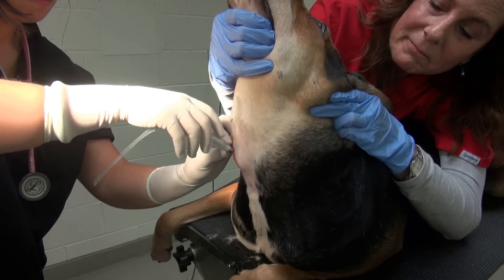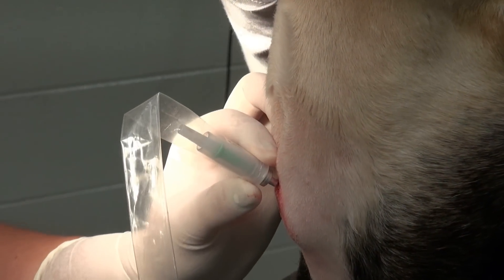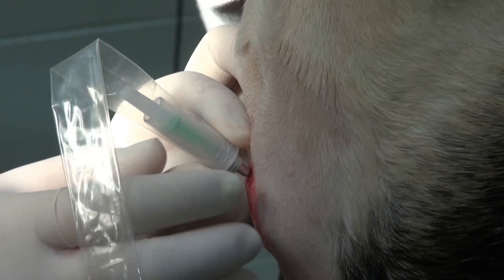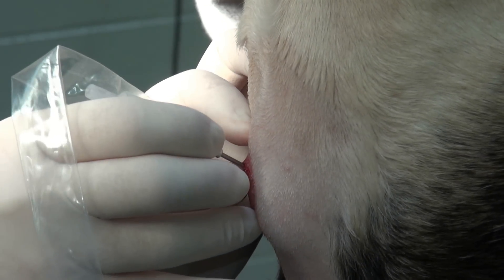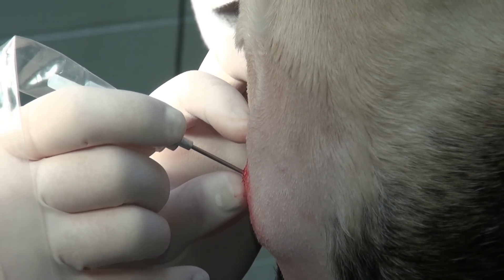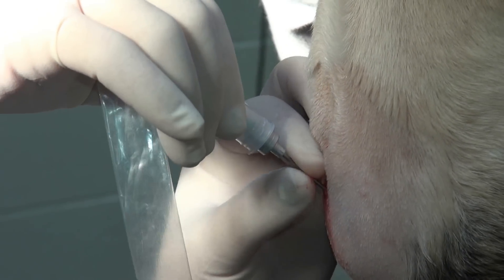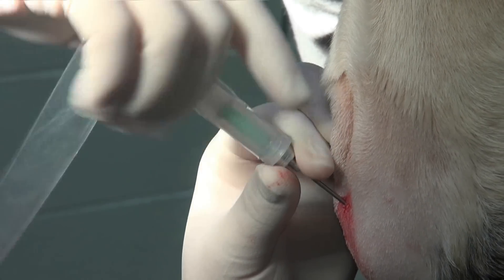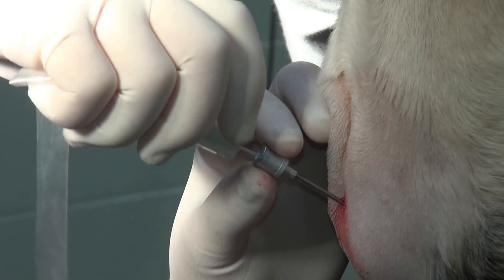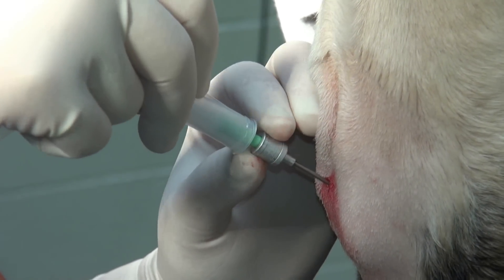Next, back the needle out a bit, then holding the needle with your left hand, rock the plastic sheath off the needle hub with the other hand. Pinch the needle and rock the sheath connector off the needle hub. Take care not to withdraw the catheter while removing the plastic sheath.